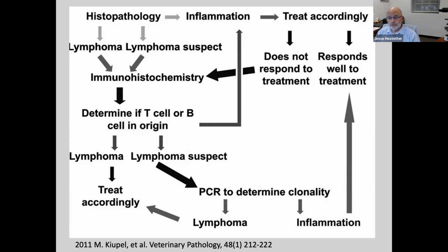And then Julie asked a really good question. Do you place any significance on the presence of plasma cells extending toward the tips of the villi? I know some pathologists who say plasma cells within the outer third of the villus are abnormal. I've read that as well. I don't know that I put a lot of emphasis on where they are in the villus. That may very likely be true, but in my experience, I've seen cases that I thought were normal, and I'll see a few scattered plasma cells all the way to the tips of the villi.